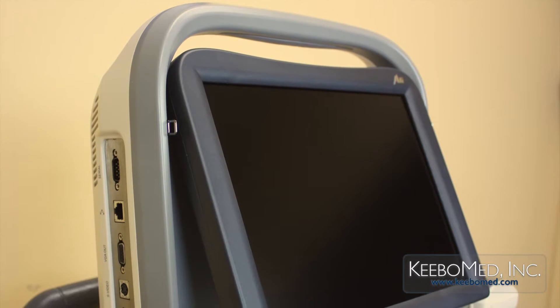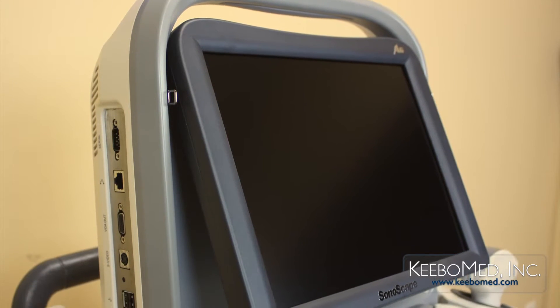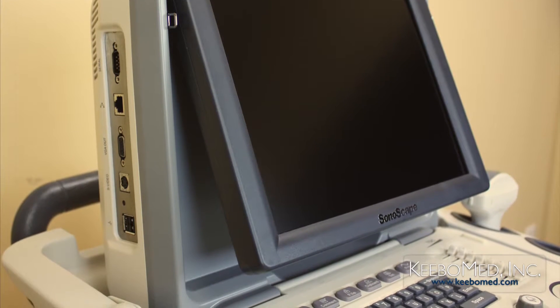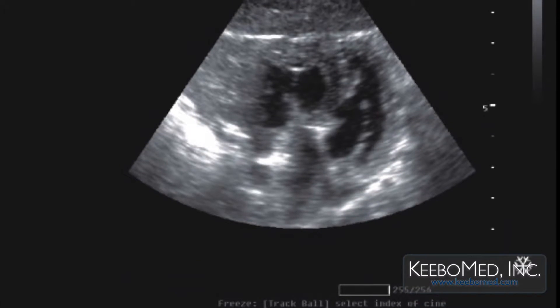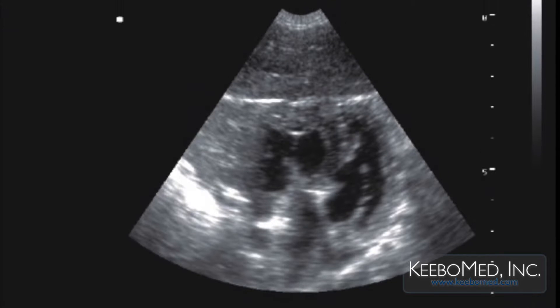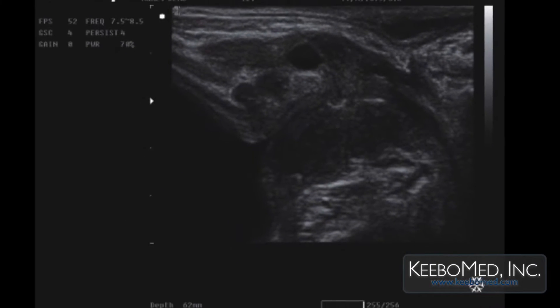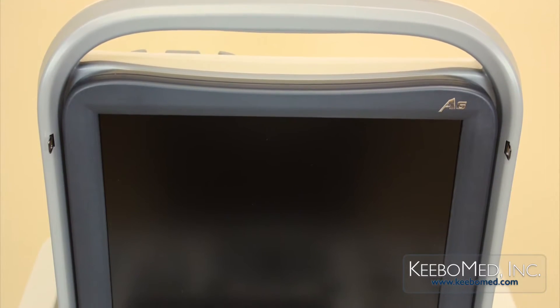Compared to conventional LCD monitors, the industrial-grade LCD monitor installed on the A6 supports the display of ultrasound images with higher resolution and has more grayscale levels. It also weighs less, reducing the overall weight of the ultrasound system.